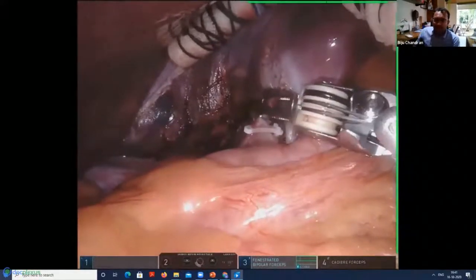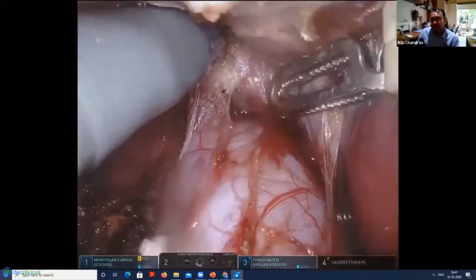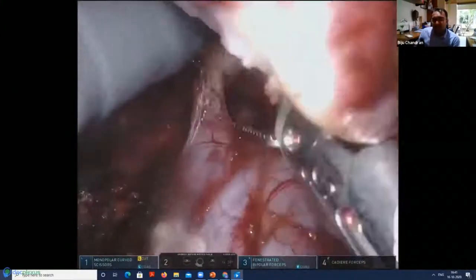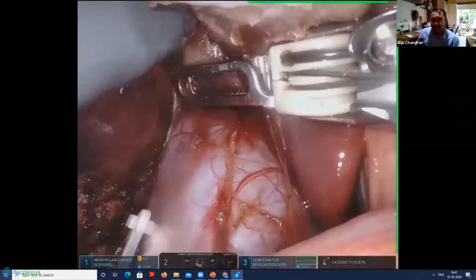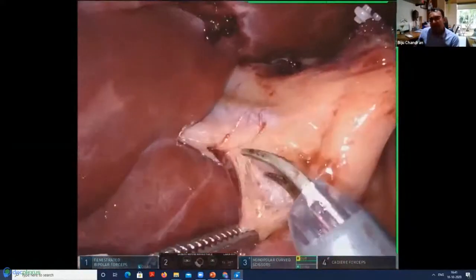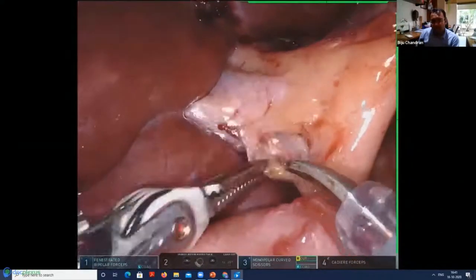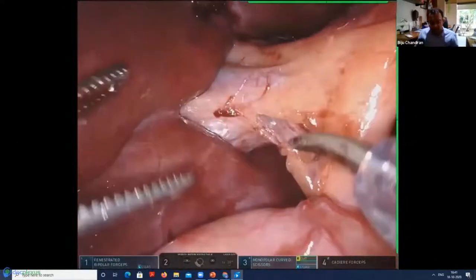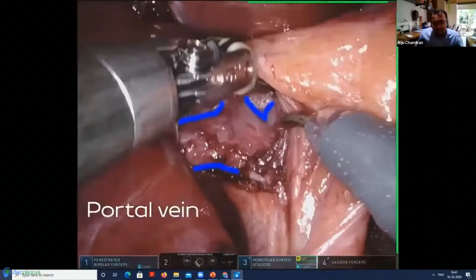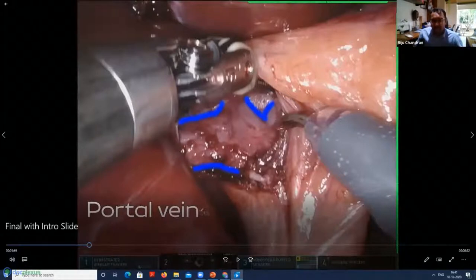We burn off the side or put a hemlock and divide it. This bit is quite important: caudate elevation from the inferior vena cava — you elevate the entire caudate process and cut the caudate. Then we come to the hilar transection. You can see the hilar dissection and the portal vein. We start on the inferior aspect. This appears like a type 2 portal vein — you can see the anterior sectoral branch, the posterior sectoral, and the left portal vein.